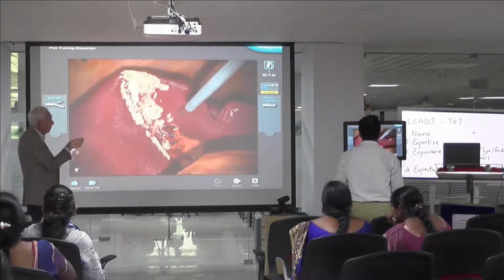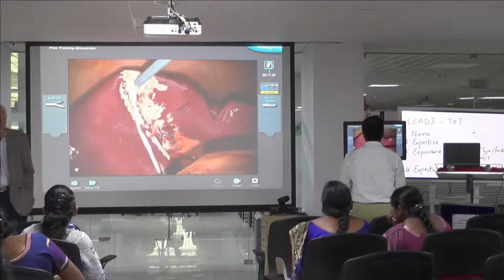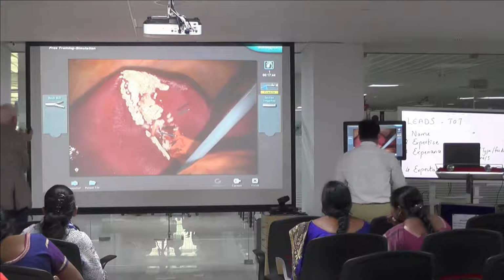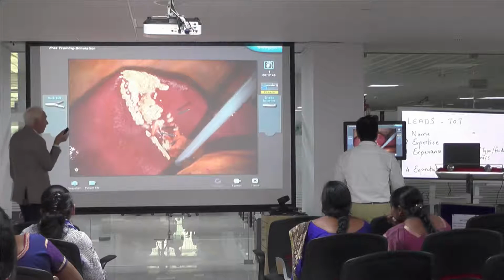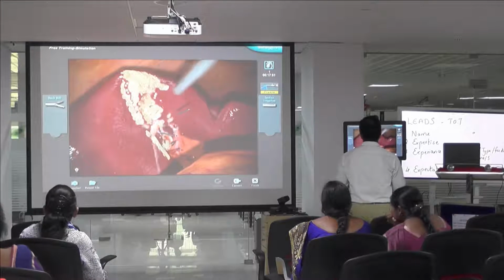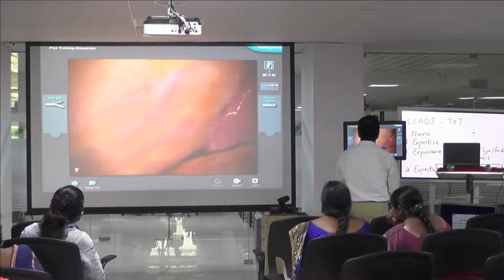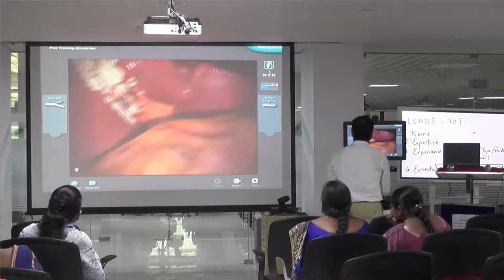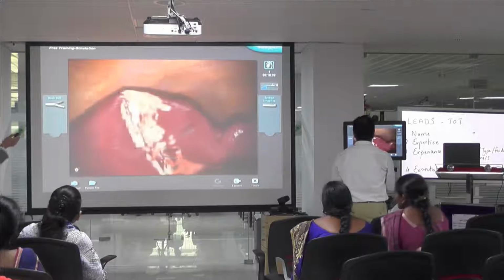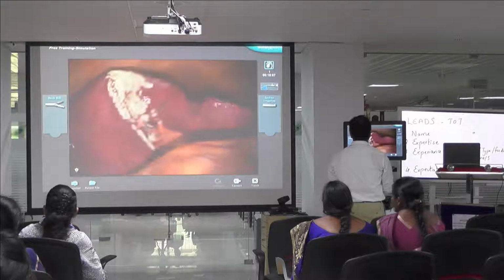If there was some pollution, you can wash out the debris and remove it. Sometimes you need to put a drain, sometimes not. And the very last component task is to check the insertion places of the trocars, because there could be bleeding from the wounds that were perforating the abdominal wall. So we are down to, I think, 7 component tasks of the procedure. Yeah? Okay.